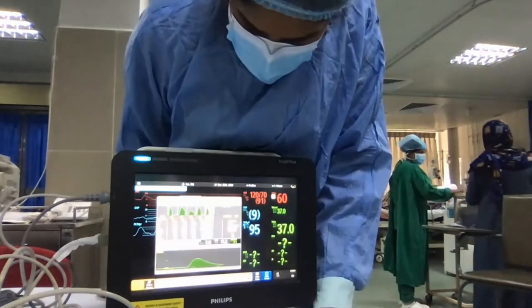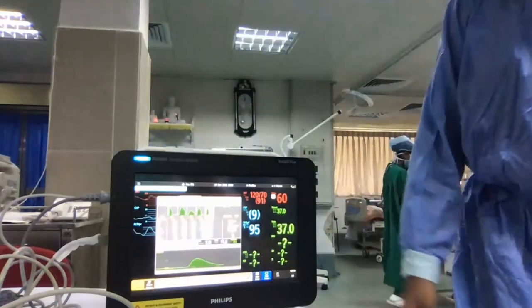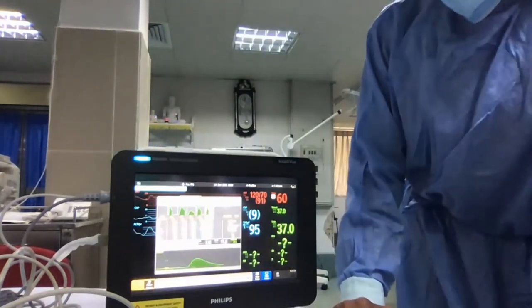This is quite similar to the pulmonary artery catheter. The same thing happens in PA catheters as well. It's the same sort of technique.